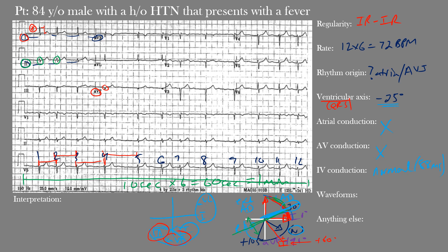In this case we see abnormal Q waves in leads III and AVF — clearly contiguous to each other. For leads outside V2 and V3, the Q waves need to be at least 30 milliseconds wide and at least one millimeter deep. The deep QS complexes visible in lead III and AVF meet this criteria. Remember, 40 milliseconds equals one small box, so these Q waves are slightly less than one small box wide but do satisfy the width requirement, and they exceed one millimeter in depth — confirming they are pathological.